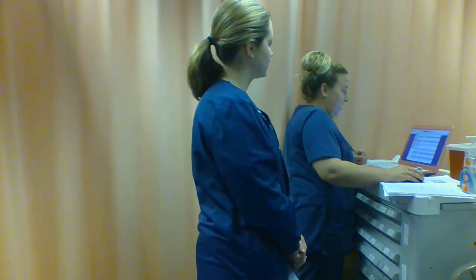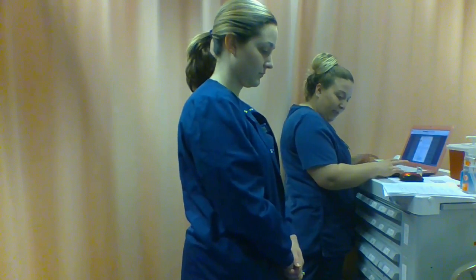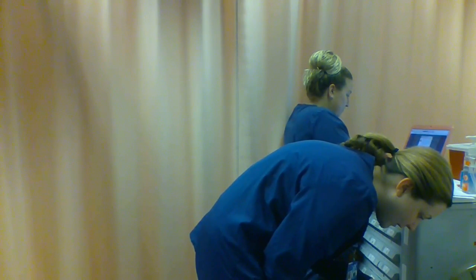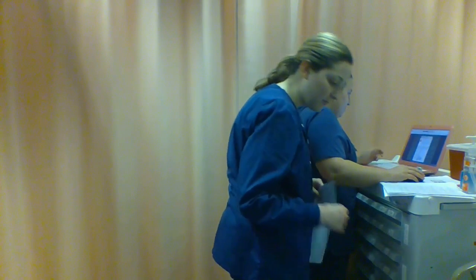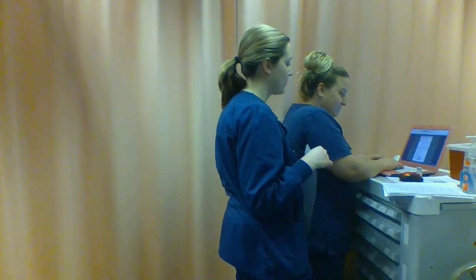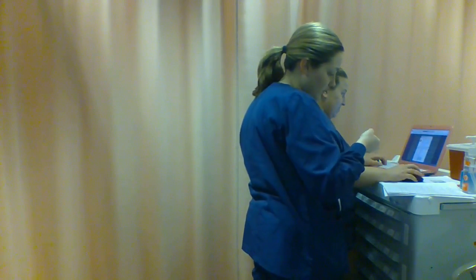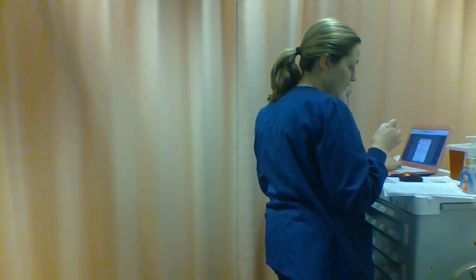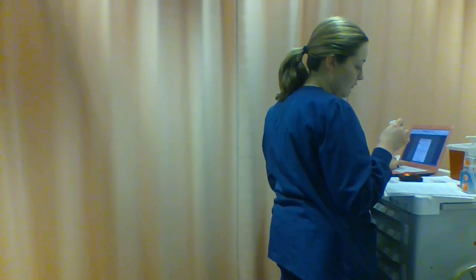And now we're going to go ahead and, because I don't have a scanner, I have to type it in. Okay. So if you want to go ahead and read me the number on his armband. It's 771-8154. And it should be Glen Light, he's 67. Okay. So this is D9B, C98, EB 983651.